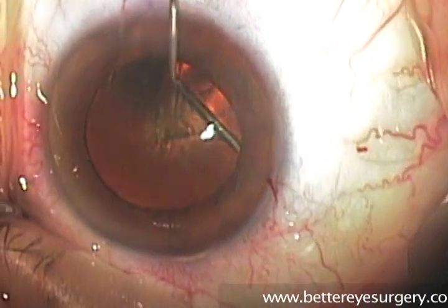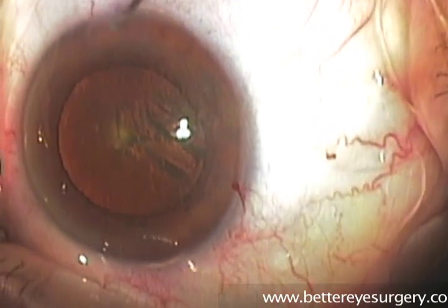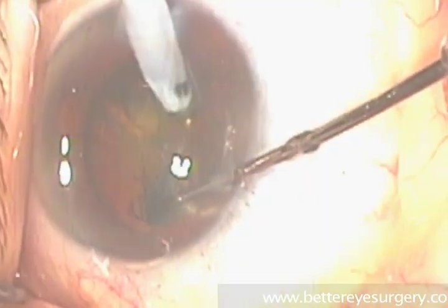We do this by separating the lens from the capsule with hydrodissection. In this step, balanced salt solution is injected to separate the capsule from the lens. This allows the lens to be rotated freely, separate from the lens capsule.